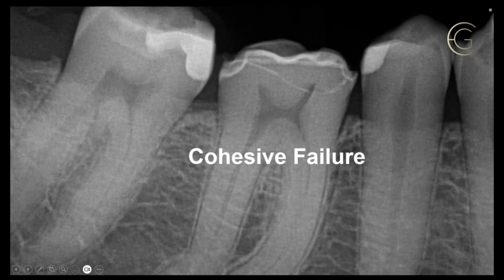Any restoration that comes back from the lab, or anyone that you make chairside, whatever you want to do, is fine. But if the lab makes it for you, you're still going to have a working or non-working interference unless you've done a face bow and all the angles, and you send it for a single restoration to the lab, which I don't think anybody does. Prosthodontists will do it with full mouth rehabilitations. But in this case, if you don't, you've got to always check.